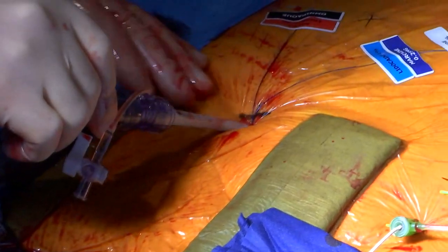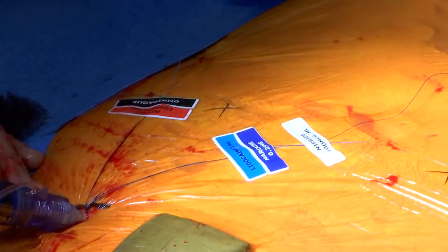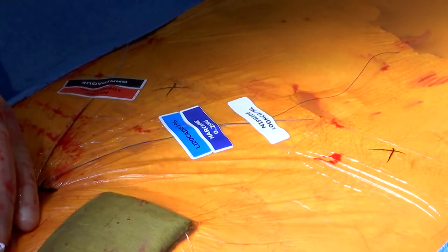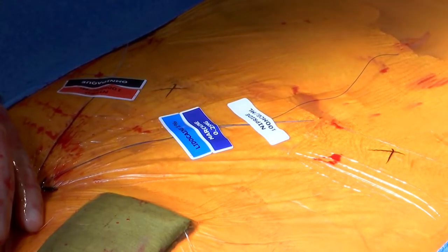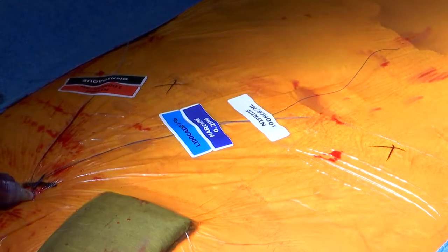There we go. It's going pretty nicely. You can see this patient has a fair amount of calcium in their aorta. Okay, so the sheath is in. We're going to back out our dilator, and then we're going to flush the sheath because we want to make sure there's no blood clots or anything.